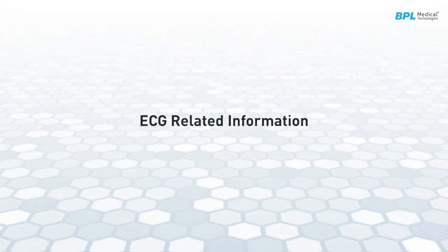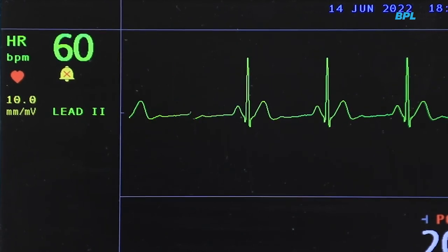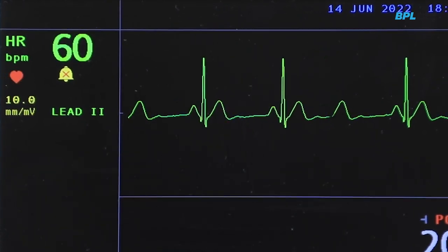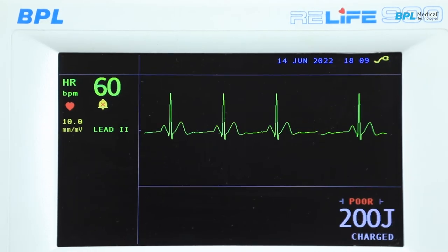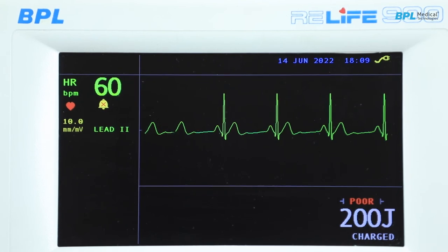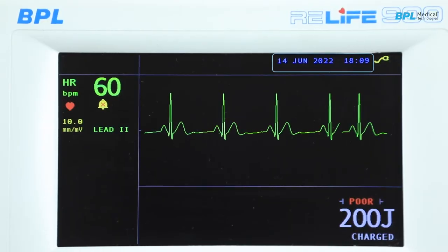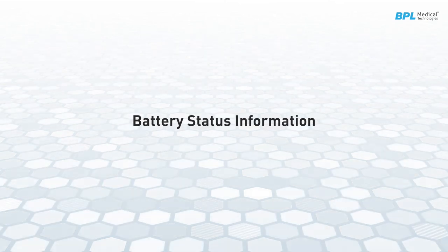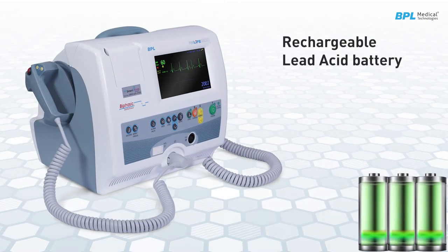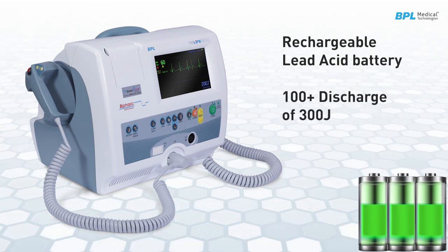ECG-related information. The ECG signal trace is displayed in sweep mode at a rate of 25 mm per second. HR rate. Heart rate from the displayed lead in beats per minute is displayed in this area. Date and time. Current date and time are displayed in this area. Battery status information. The defibrillator has a rechargeable lead acid battery with the capacity of more than 100 discharges of 300 joules.